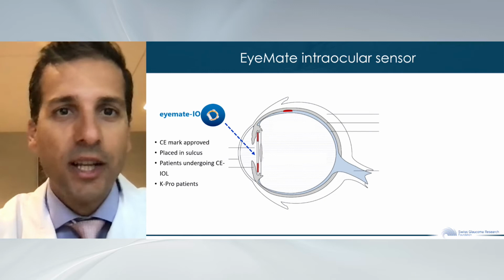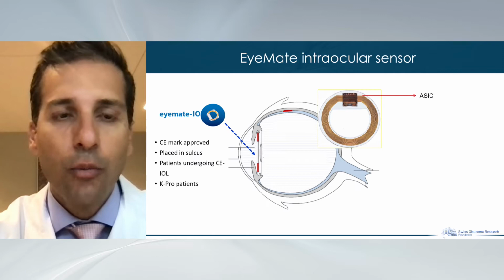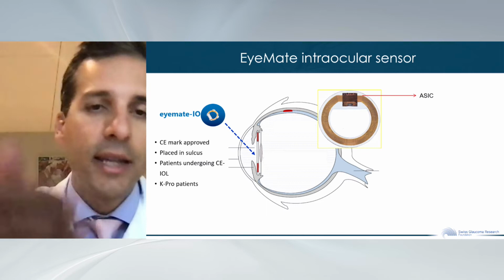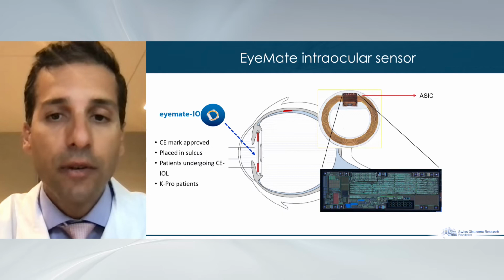That's why having implantable sensors that measure absolute IOP would be very helpful. And another startup, this time a German startup called Implandata, developed several years ago this round-shaped sensor that can be implanted during cataract surgery into the ciliary sulcus. It has pressure sensors which measure IOP changes. You use a handheld external device to power the sensor and receive the data in return. And here's an example of a patient's IOP measurements performed round the clock by the patient at home for 950 days in a row.